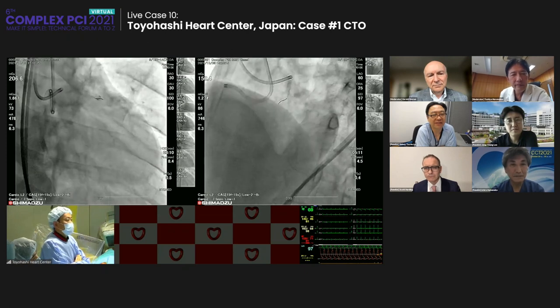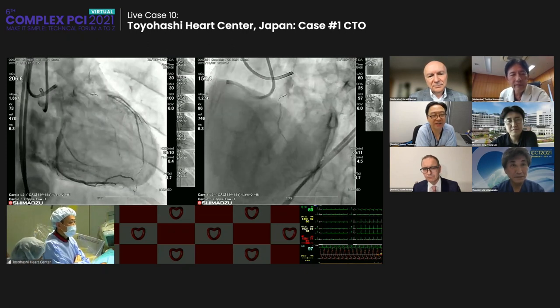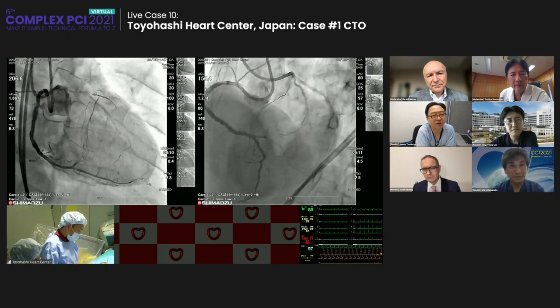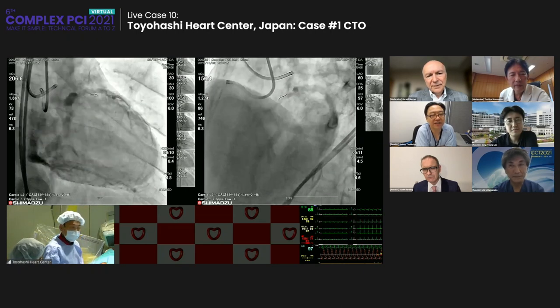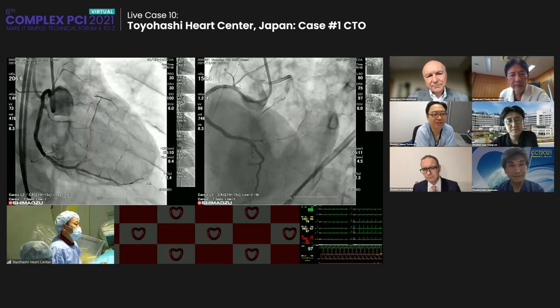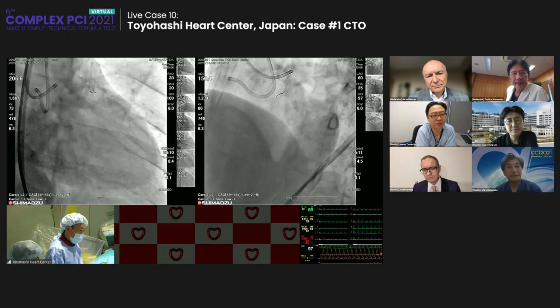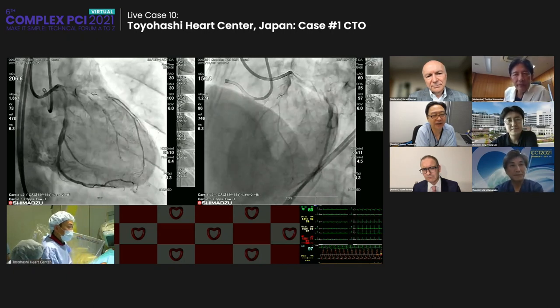But I guess imaging would need to be done, and it's pretty routine. If you get through either way, you can try to readjust yourself so that you are as luminal as possible. If the equipment can pass, then you can re-stent it, even though you may have to crush it, depending on what you get. And I think a dual lumen catheter either way may be useful, particularly antegrade. You start a bit antegrade and see how far you get, because there may still be a reasonably tractable lumen compared to your previous OCT.